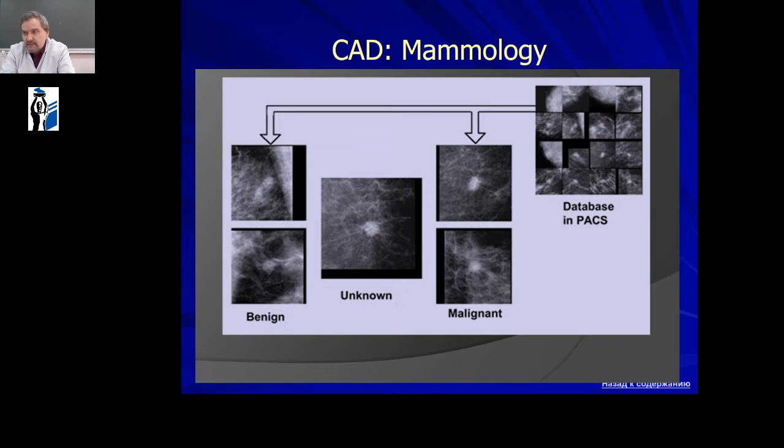The following slide shows an illustration of a computer-assisted diagnosis system. The system differentiates the norm and pathology based on previous training.